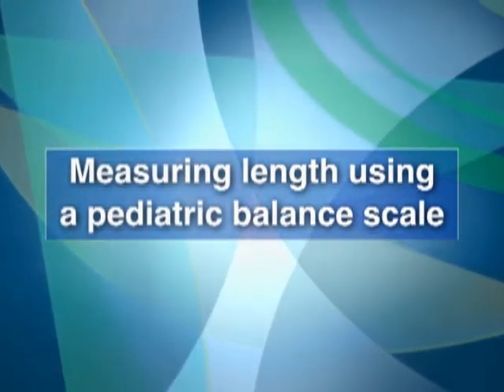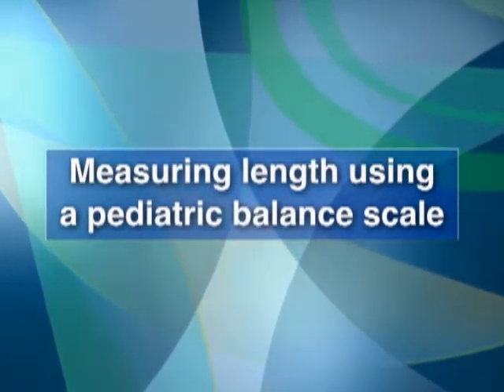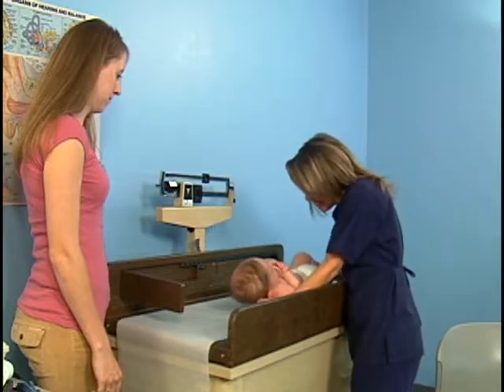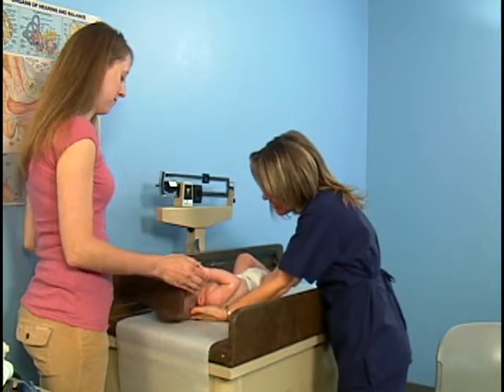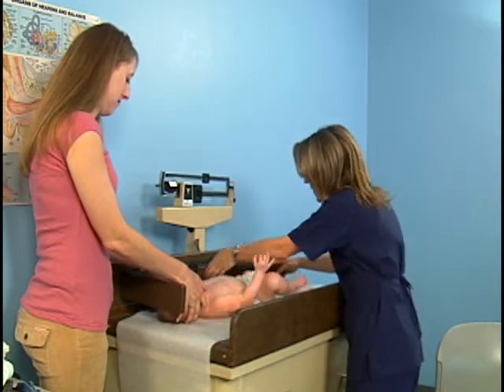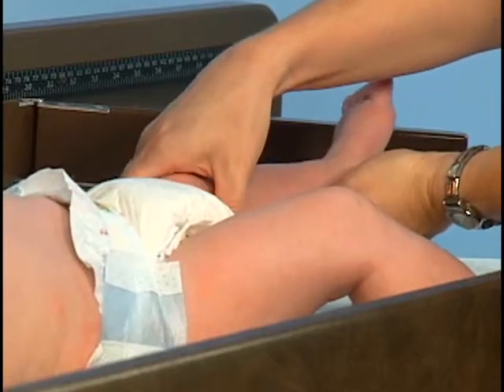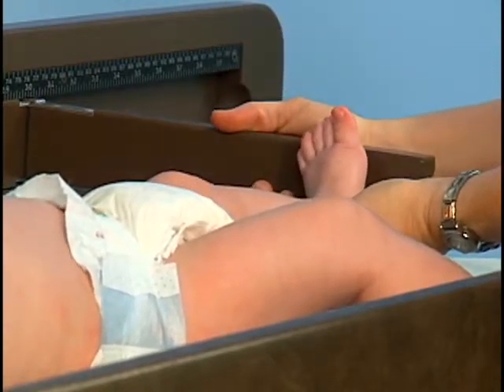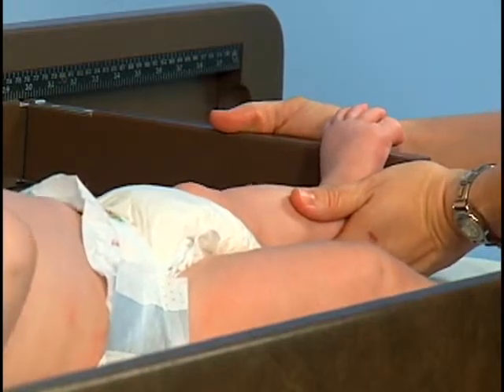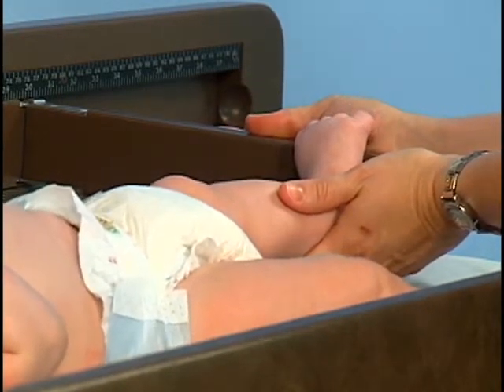Next, the child's length is measured using the pediatric balance scale. To do this, place the vertex or very top of the infant's head against the headboard at the 0 mark. Ask the parent to hold the infant's head in this position. Straighten the infant's knees and place the soles of his feet firmly against the upright footboard. The footboard should be at a 90-degree or right angle to the measuring bar.